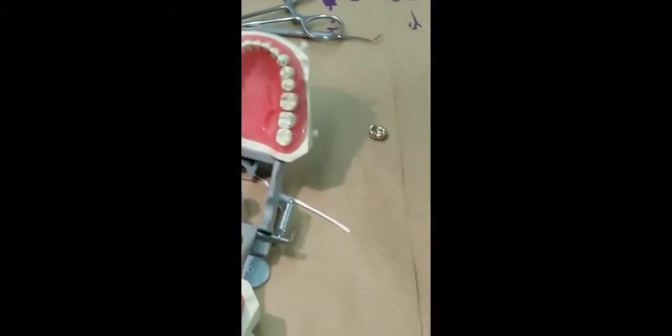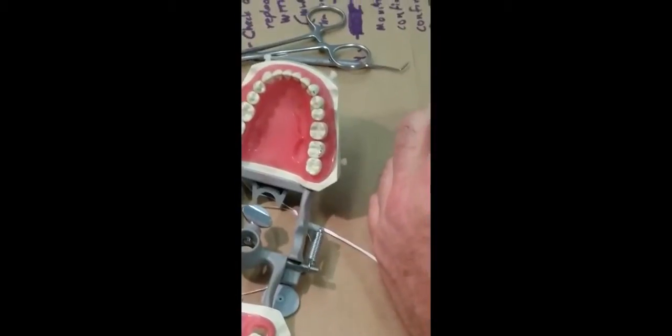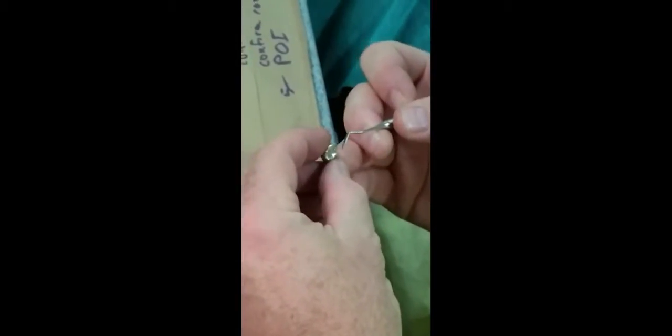You would mark the excursive movements and see where the crown contacts — there may be a slide mark up on an incline. If it's hard to get it to mark on a polished surface, put a little vaseline on it. For some reason that dissolves a little of the wax binder and gets it to mark better. So even though it seems counterintuitive, it does help. If you're not getting a mark, apply a little vaseline, make sure the foil is very thin, then go through those excursive movements.